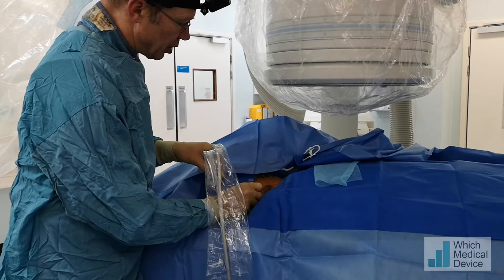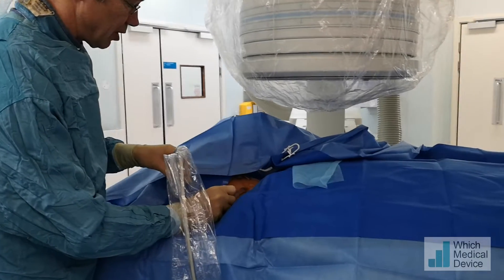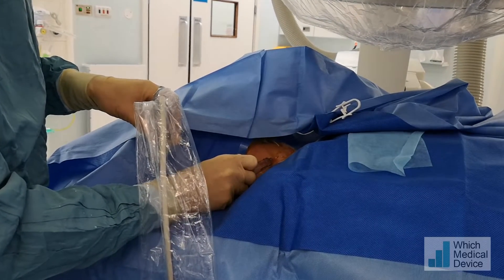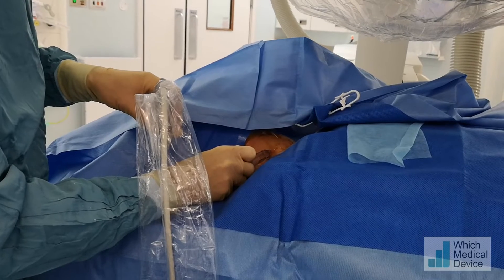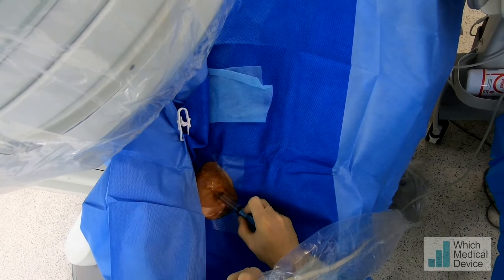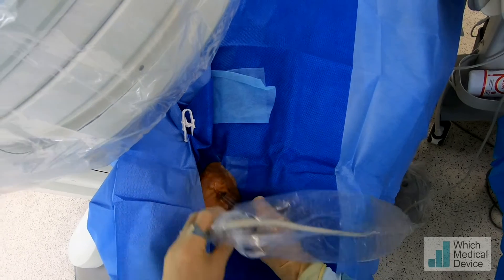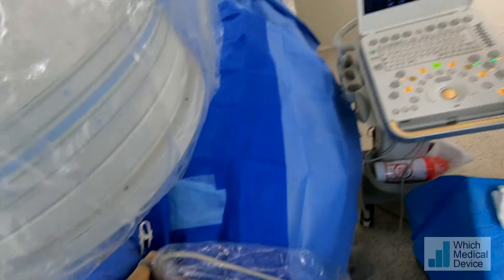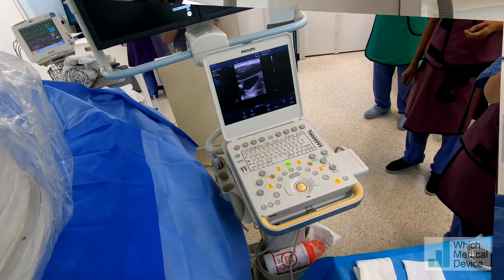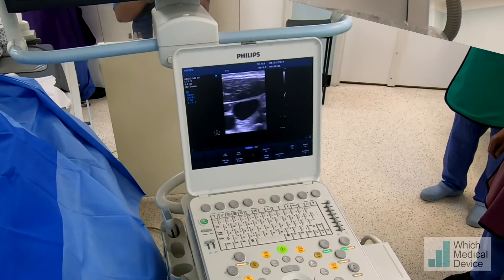And a bit of a sting — I'm just going to inject this nice and slowly. I don't believe in raising a big bleb, because that's very painful, so we're just doing it nice and slowly and getting the anaesthetic to infiltrate slowly. Now we're just going to go a little bit deeper, down towards the jugular vein. You okay there? Shouldn't really feel much — you might be a little bit nippy.